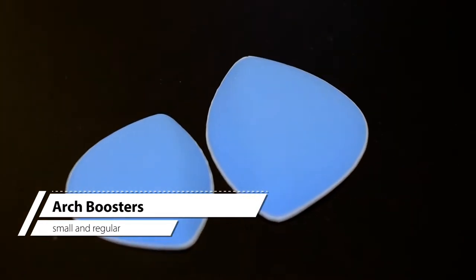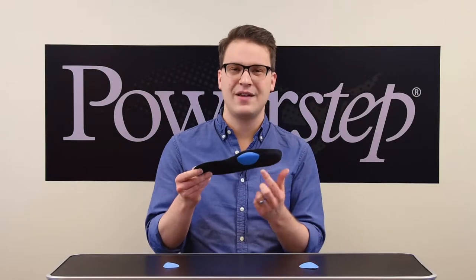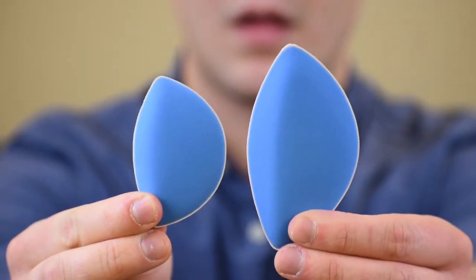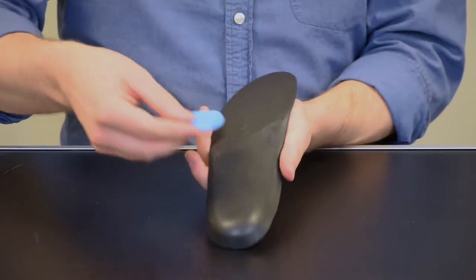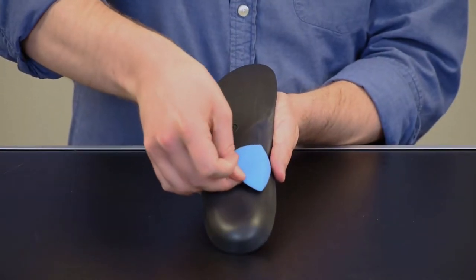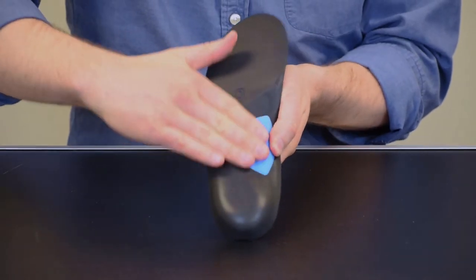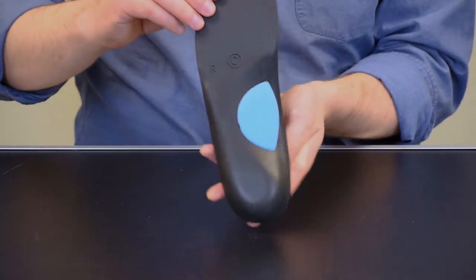Arch boosters help provide extra support under the arch and midfoot, filling the open space under the arch to prevent excess movement. These also come in small and regular sizes. To apply, remove the adhesive backing from the cushion and attach to the bottom of the orthotic directly under the arch with the adhesive side against the orthotic. The semi-circular side should face toward the center of the orthotic. Adjust the position as necessary for comfort.